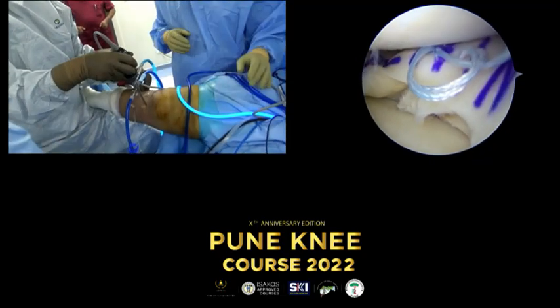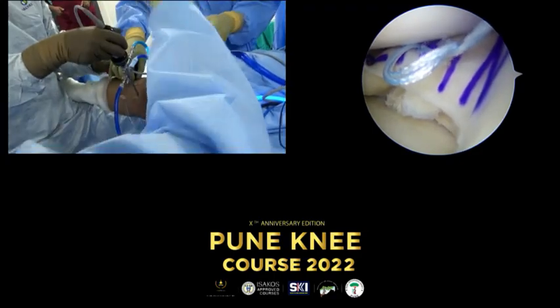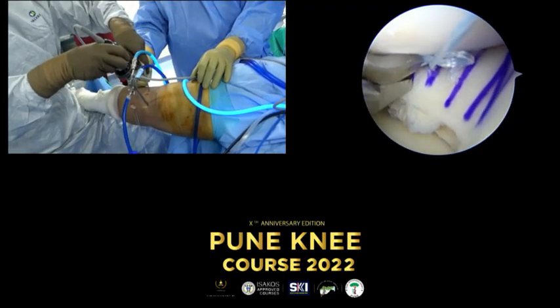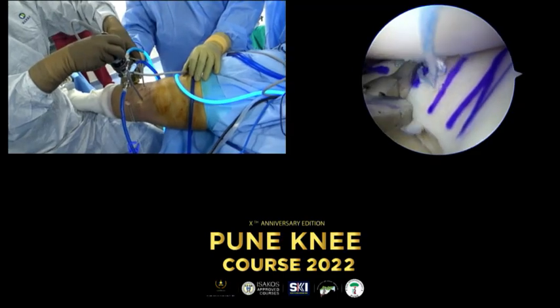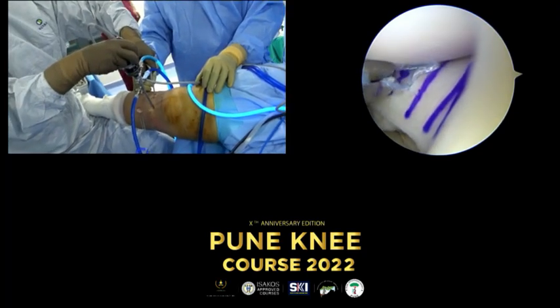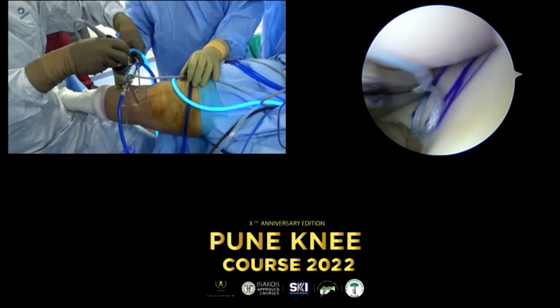Do we have a cocker? Can you hold this? No, the scope. You see what I did? So the allograft almost always tends to go more and more cranially. Yeah. And I think one trick that I use is I try and joystick it. So when I put the suture in, I then push it downwards and then take it there. I think that somehow helps me at least.